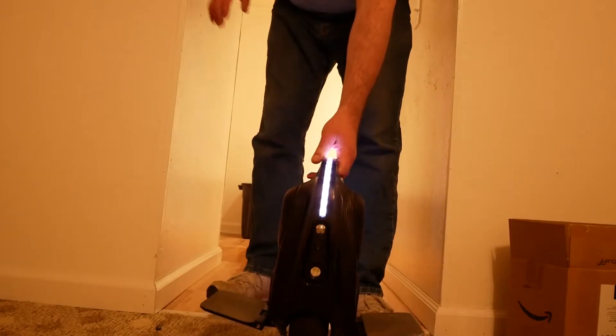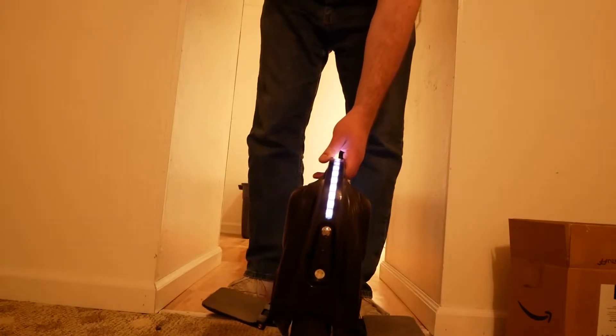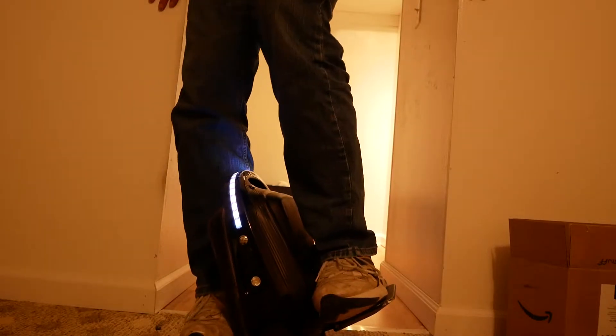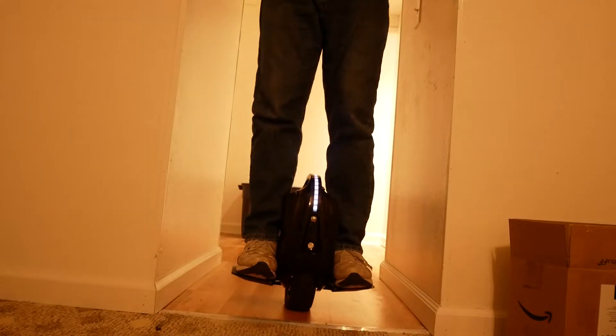I'm right-sided so that's my dominant side. So the first thing I'm doing is putting my right foot on it, setting it down on the carpet, and then I keep my foot neutral — not pushing backwards, not pushing forward — on the pedal so that the motor doesn't run. And I have to use the wall right now so that I can stand on the thing and then get my other foot on it. And now I'm totally vertical.